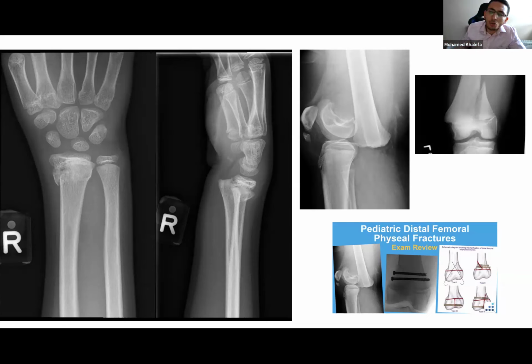And when you fix it, you try to spare the physis if possible, like putting screws across, but most of the time you can't spare the physis. You have to go through the physis, and it's fine. It's not going to damage the physis. You go with a smooth pin, without threads, low speed to avoid the heat, and you try to have somebody experienced do it, so you avoid going with the K-wires 100 times. So you damage the physis. So single entry, smooth pin, low speed, it's fine. You can get away without damaging the physis.